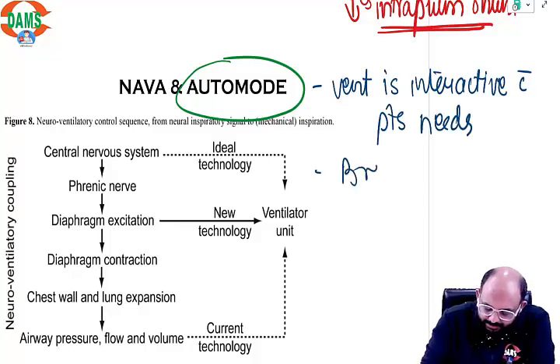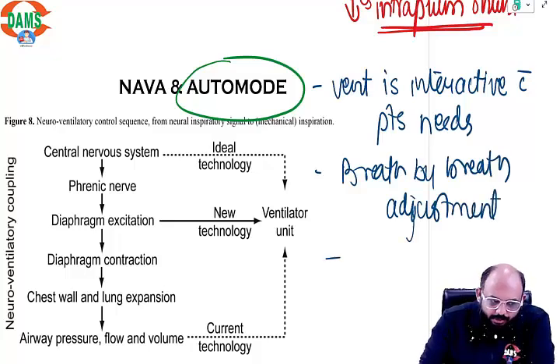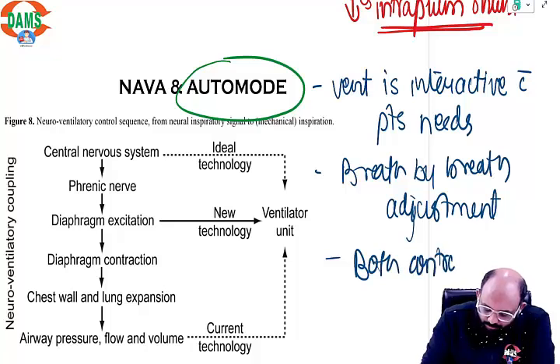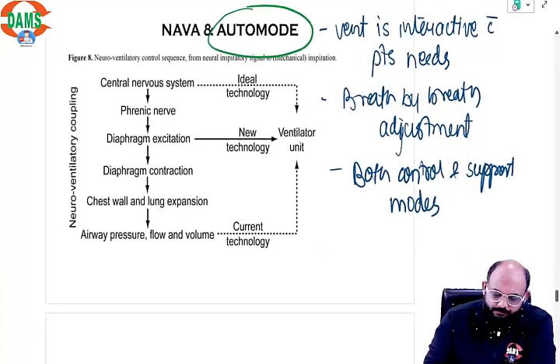So there is a breath by breath adjustment, and both control and support modes are used. That is auto mode.